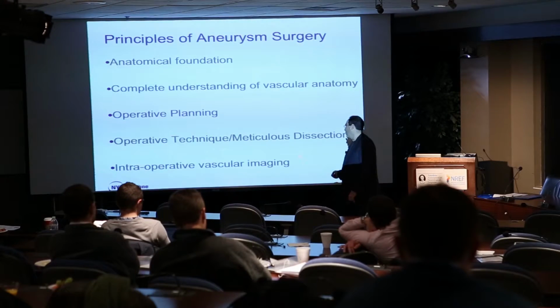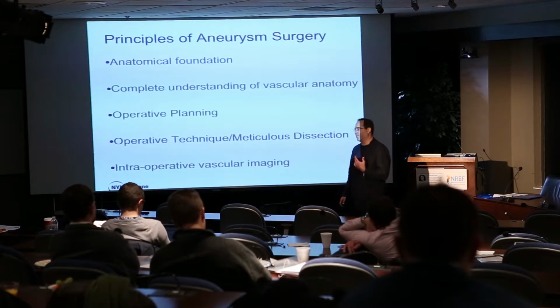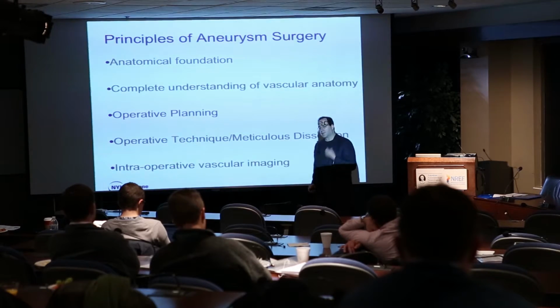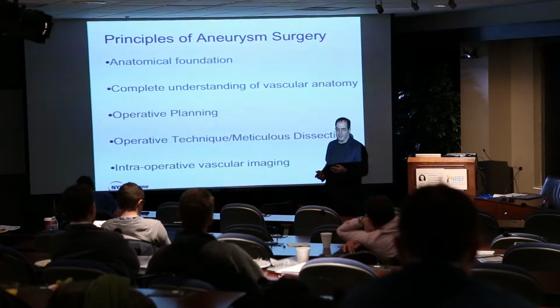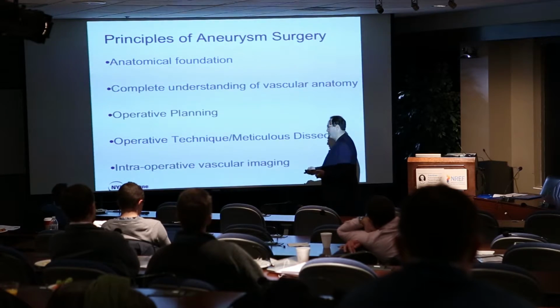And always have some type of intraoperative vascular imaging. You'll see in one of my videos, I can do intraoperative angio pretty quickly, but indocyanine green, some type of way of knowing that the branches and everything are filling and the aneurysm isn't when you're done, is incredibly useful.